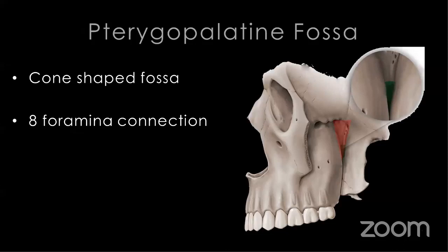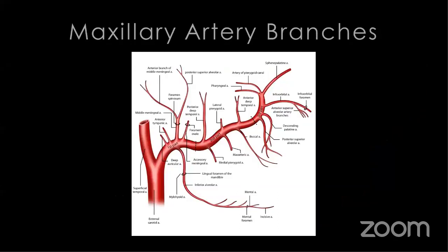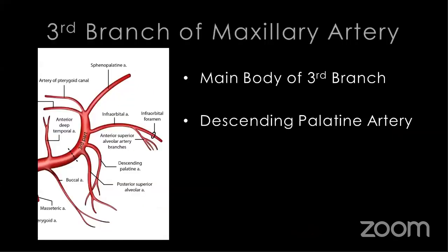Now, in this fossa, there are 8 different foramina. In particular, things that we want to avoid in this area are the third branches of the maxillary artery, because this gives off multiple other branches. What's of particular concern to us for placing a pterygoid implant is the main body of the third branch of the maxillary artery and the descending palatine artery.